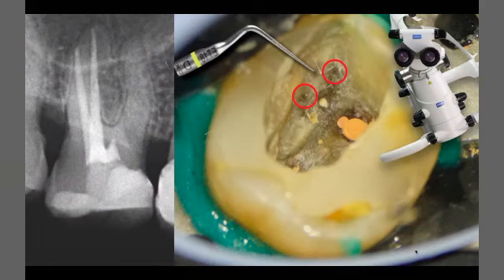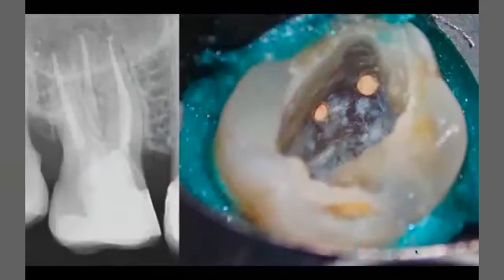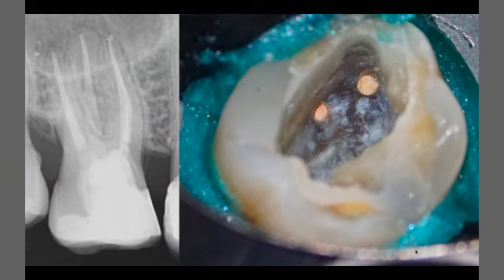Here, it's very difficult to put your manual K file directly in the orifice. So I go directly with pre-flaring rotary glide path files just to open 1 to 2 or 3 millimeters of the root canal, then start negotiation with the manual files. It's very difficult to put manual files directly inside this very narrow and calcified canal. After that, normal cleaning, shaping, and obturation. So I think I have finished.